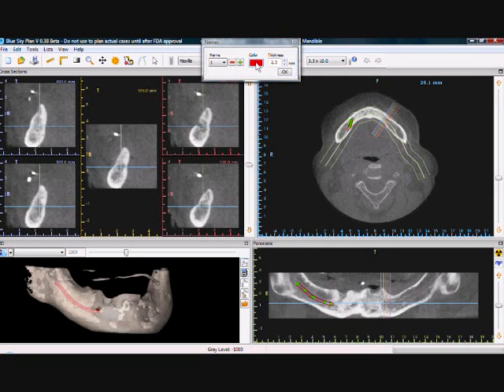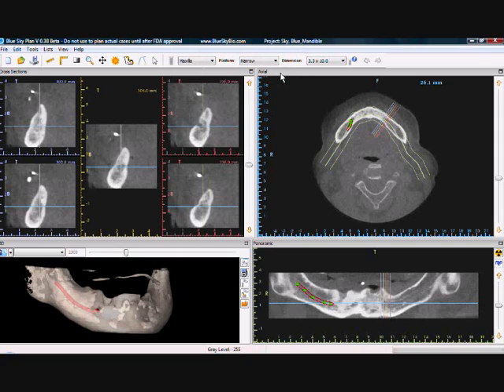The nerve color and the nerve thickness can be adjusted in the nerve tool box on the top of the page. This concludes the Drawing a Nerve tutorial.